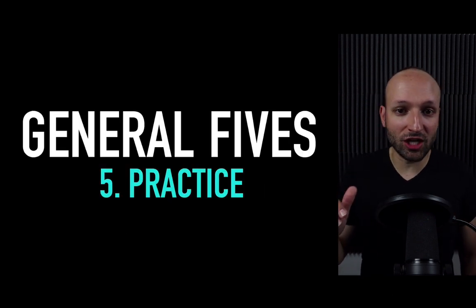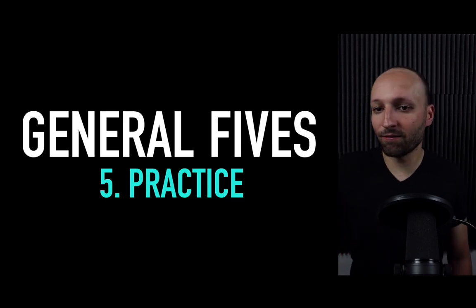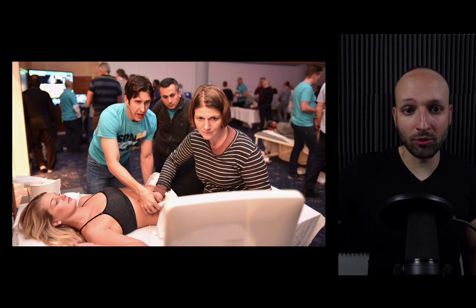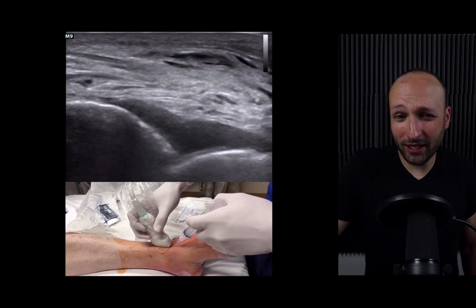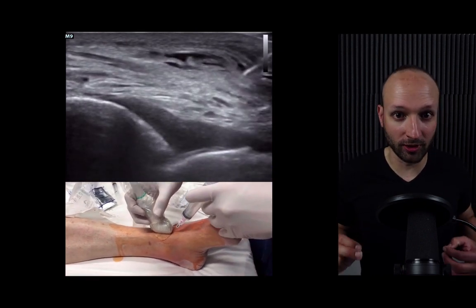Now, the last general tip that I have for you is to practice. You can definitely do this at a course for sure. Practice on your patients like we mentioned. And you can practice procedures. I mean, procedures are a little bit tricky. Like you might not want to do your very first ankle arthrocentesis on a real patient.